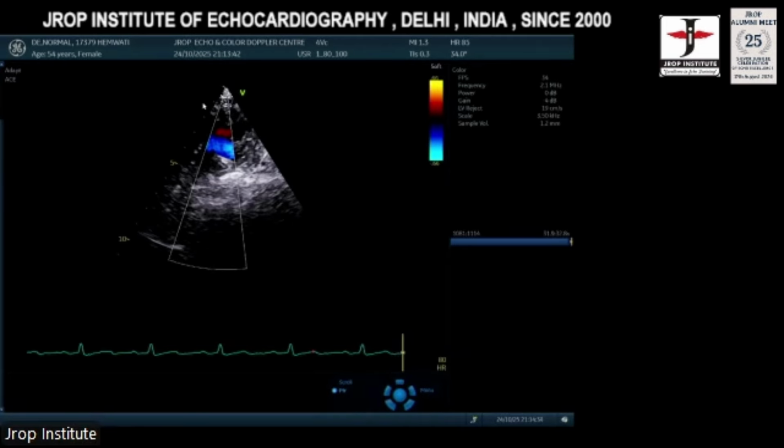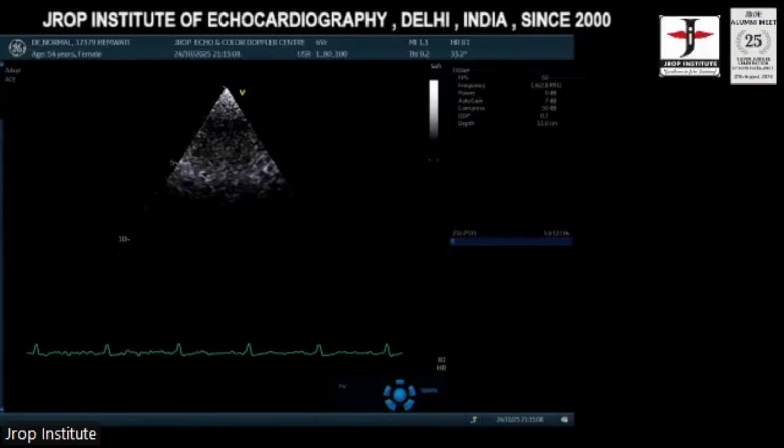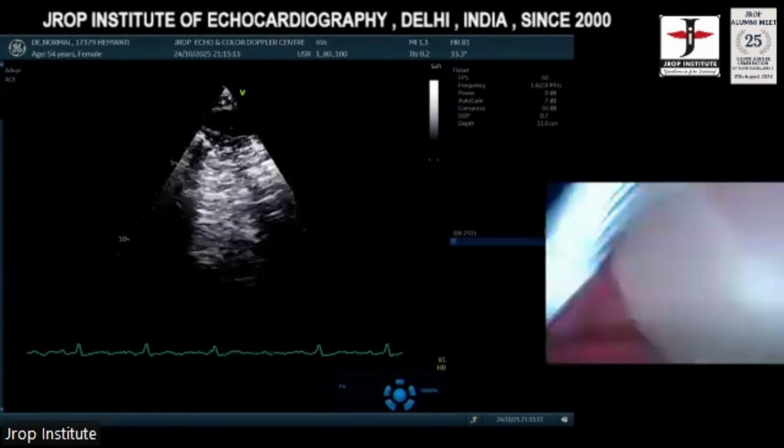Dr. Chandrahas Patidar, roll number 37. Good evening, sir. Sir, I want to know, in the subcostal view, you showed us all four chambers, and by rotating counterclockwise, you showed the IVC also. Correct. But sir, can we get other views from the subcostal window, like the PLAX? Can we also get that angle from subcostal?